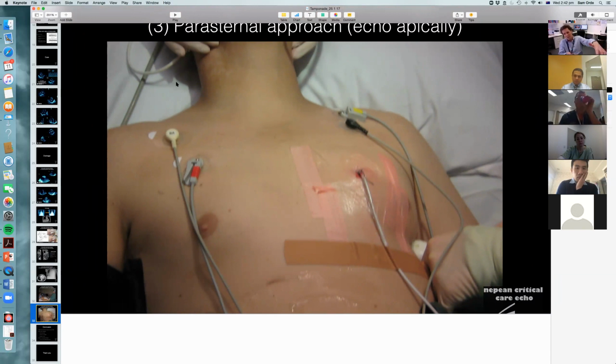I'm all sterile at this stage. I'll then give the probe to someone else, generally to put subcostally or parasternally. I'll have marked where that echo probe was with the end of the needle cap. Then I take my needle, I go on that mark I've made on the skin, I know where I've got to aim it on the back, and you stick it in.